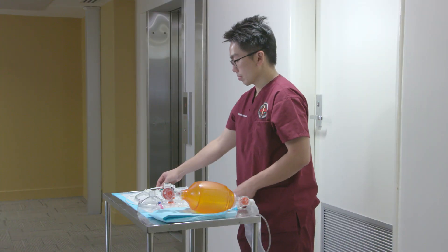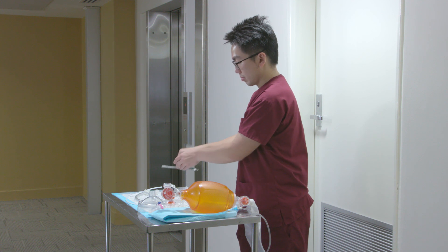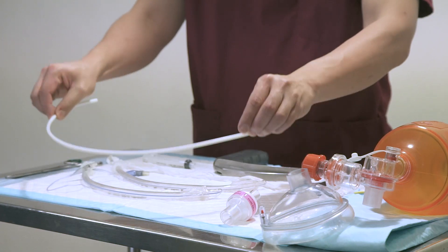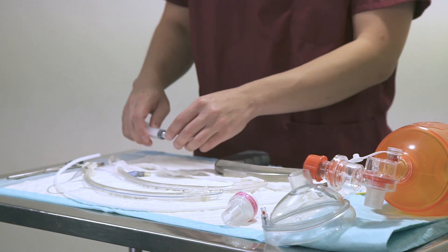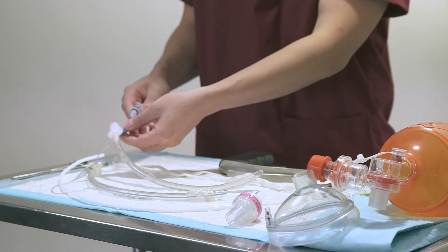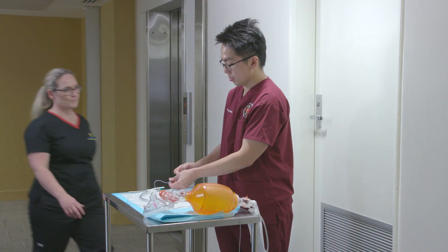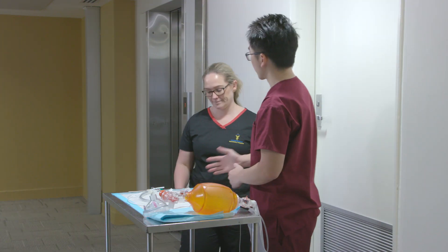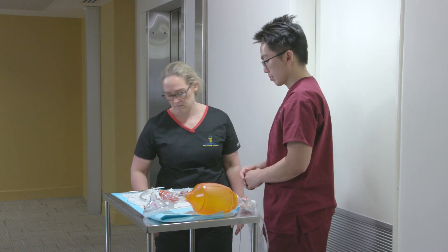This is a demo video illustrating how to intubate a suspected or confirmed COVID patient. Before intubation, the team should assemble outside the patient's room and plan, using an intubation checklist.